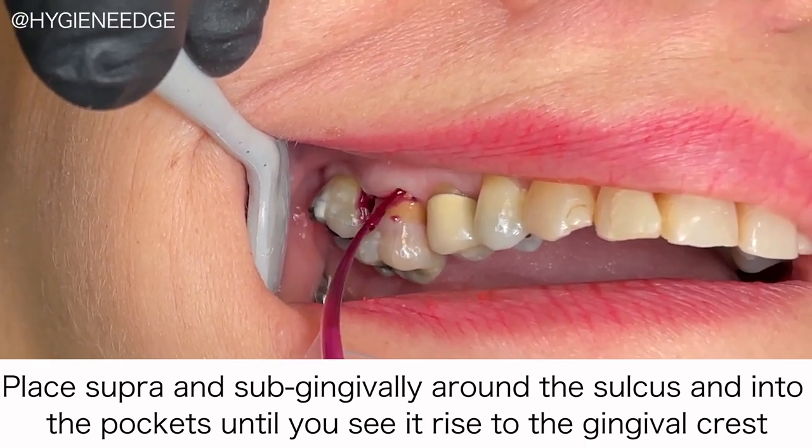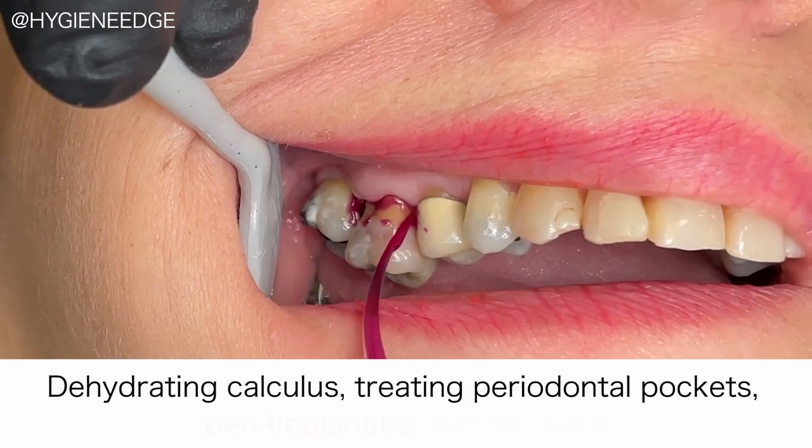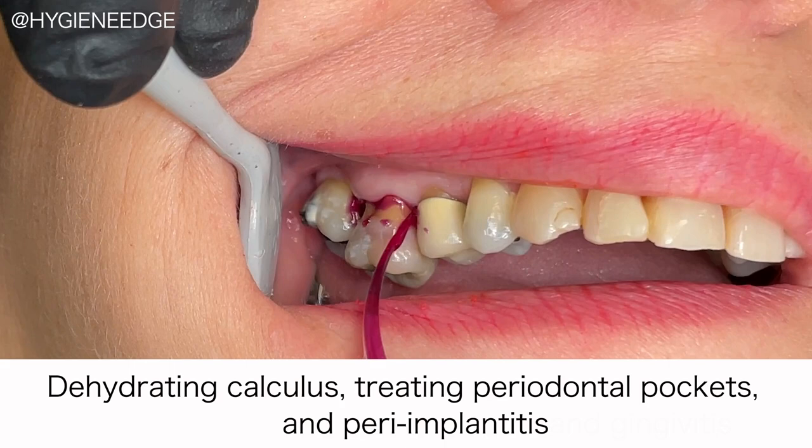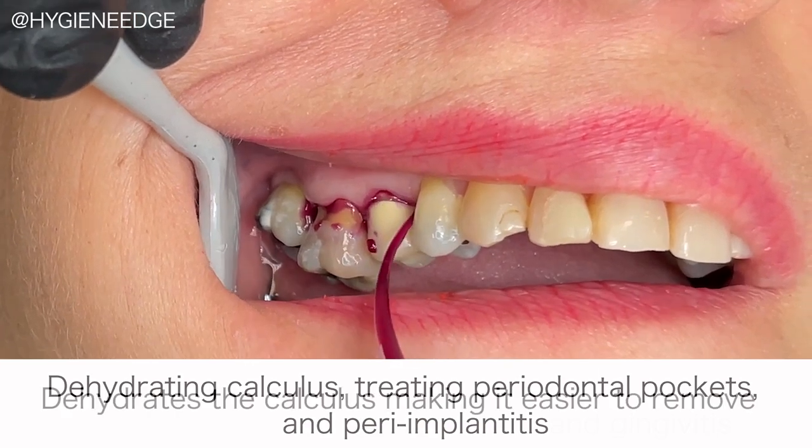It can be used both pre- and post-scaling for a variety of treatment situations like dehydrating the calculus, treating periodontally diseased pockets, and peri-implantitis. Hybenex can flow into the threads of an implant, removing the bacteria and reducing the chance of peri-implantitis.